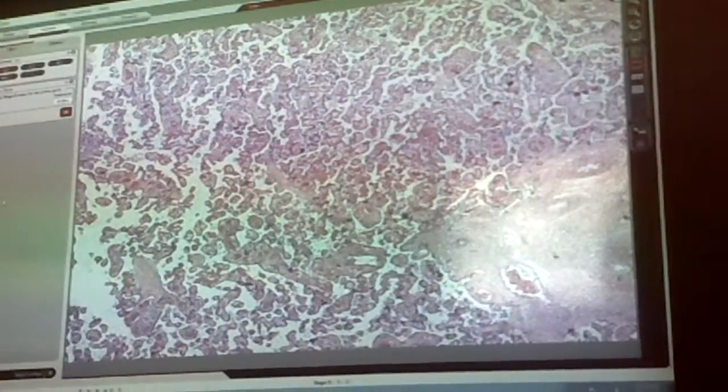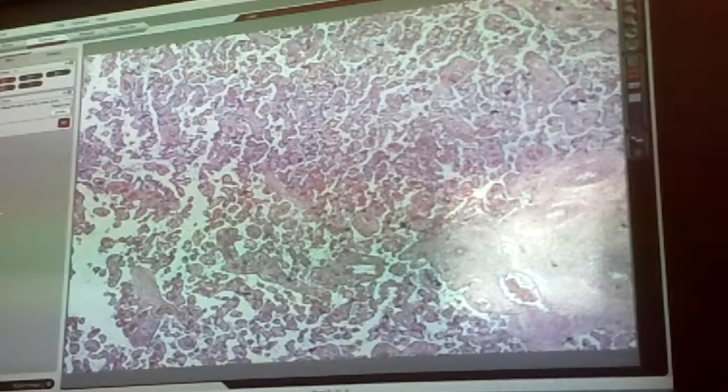All right, for the umbilical cord, I'm going to go through it. Again, I cannot show you everything all at once. But if you look at your slide up in the light, you should see 2 circles that look alike and 1 circle that looks gigantic. The ones that look alike are the arteries. The gigantic one is the vein.